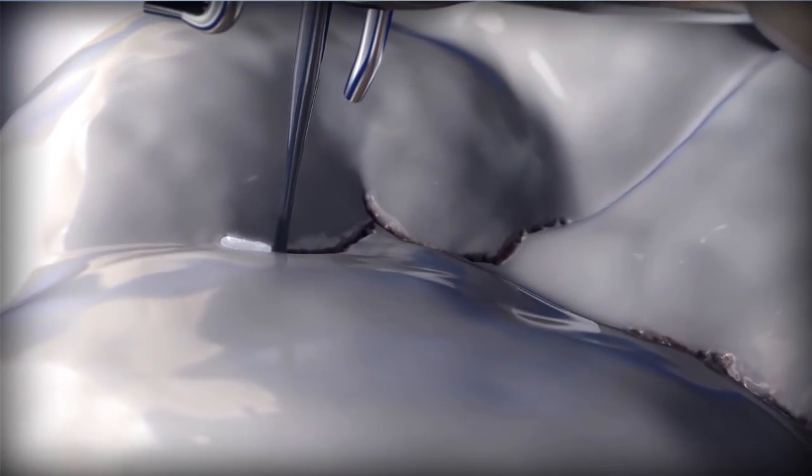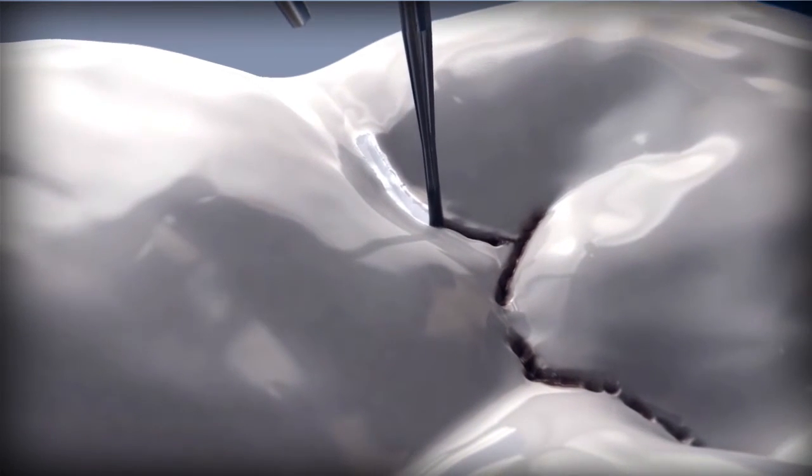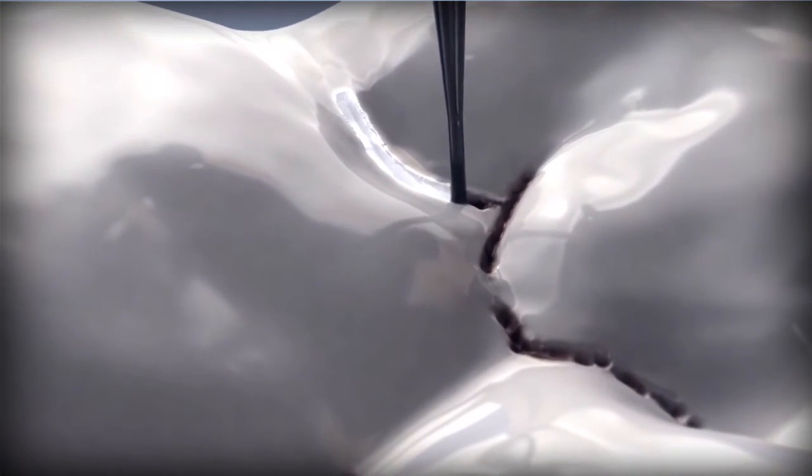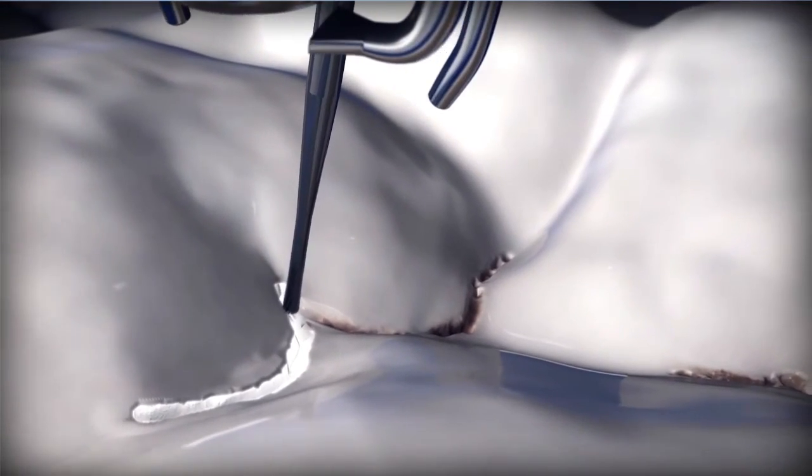By the way, the device itself is universal, and instead of a dental drill, it can also use other tools as well as compressed air, abrasive material, or a laser. This makes it possible to use the technology not just for cavity removal, but for preventative tooth cleaning as well.